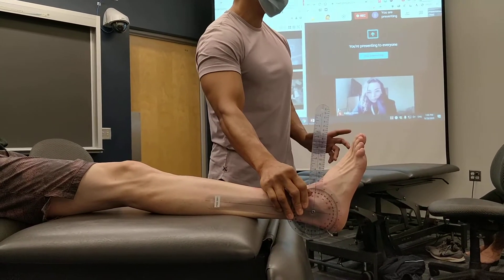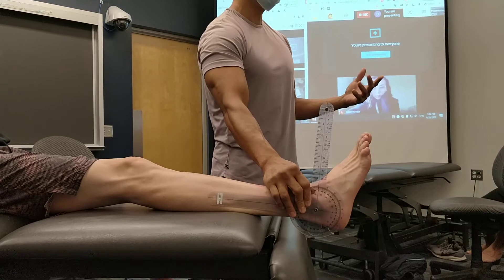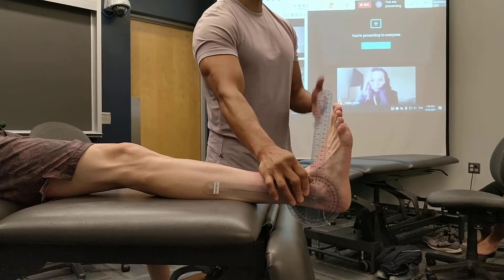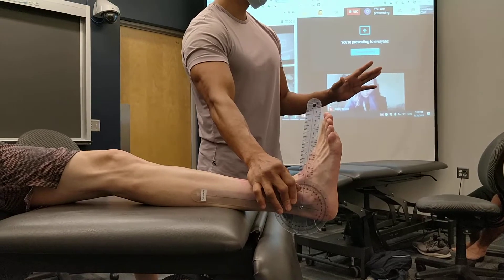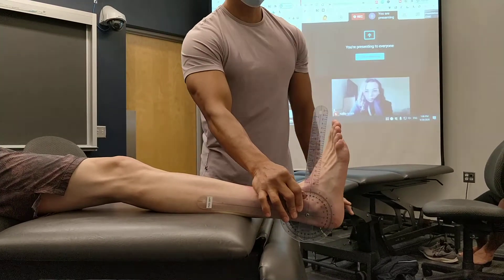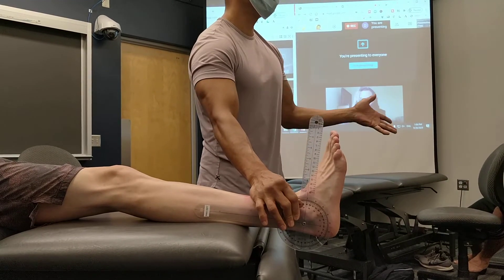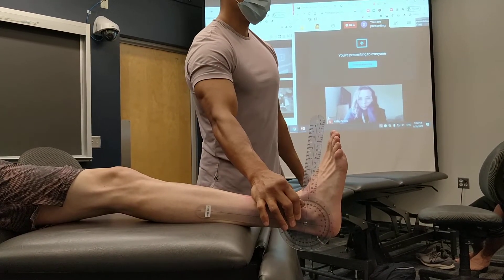So the goniometer now is at 90 degrees, and this is where the variability comes in. I want to have his ankle at 90 degrees, so I'm using one of two landmarks. You can use the plantar surface of the foot or the shaft of the fifth — it doesn't really matter. But what you want is the ankle at 90 degrees.